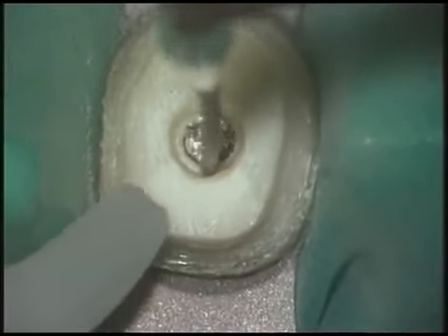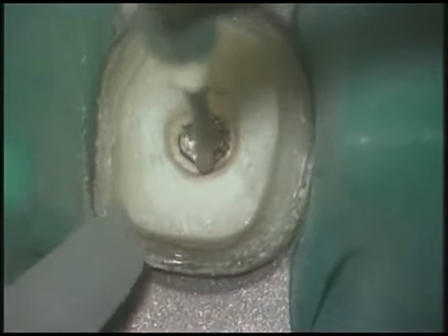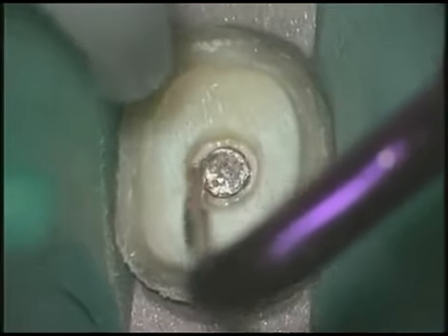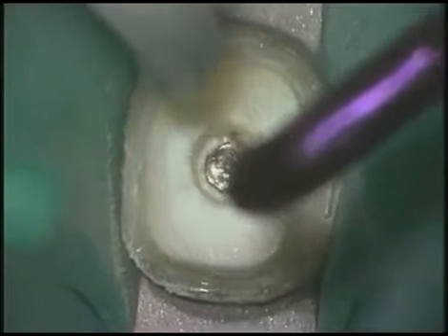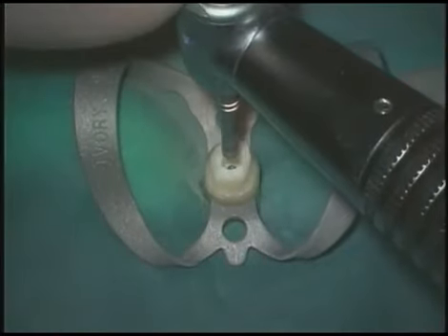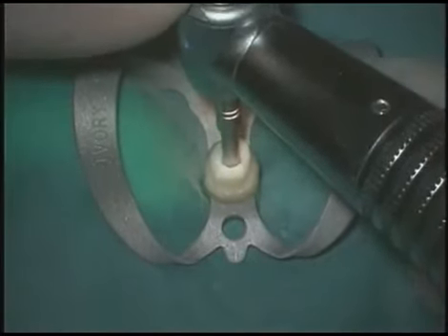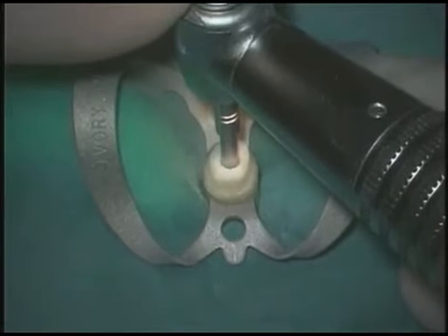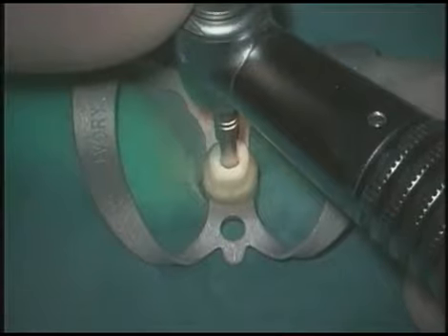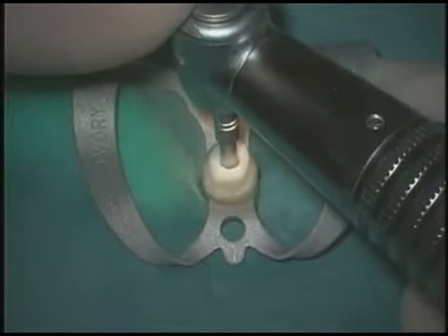Here we have created a staging platform. This platform will accommodate a parallel-walled, ultrasonic, small-profiled instrument. Continue trephining procedures to expose another 1 millimeter of the post. The Cavo slow-speed electric handpiece can use a trephine to machine down. I'm going to machine down more of the post, which will preserve lateral dentin.